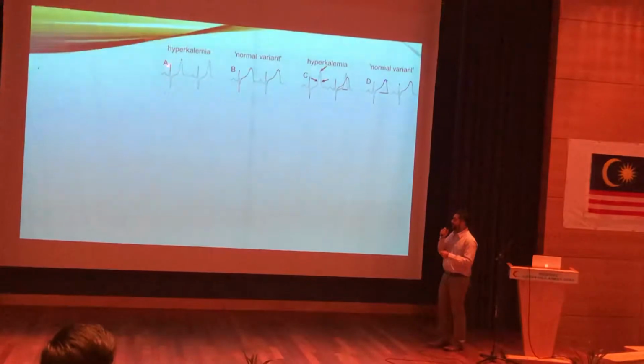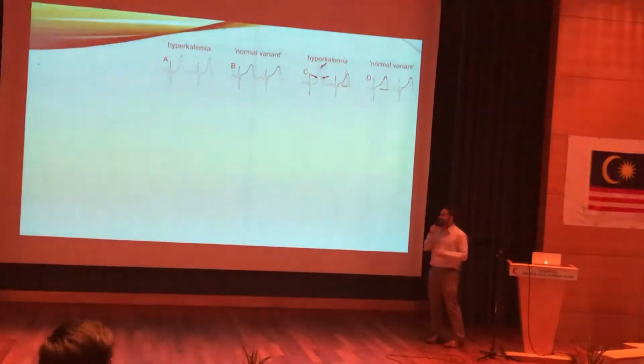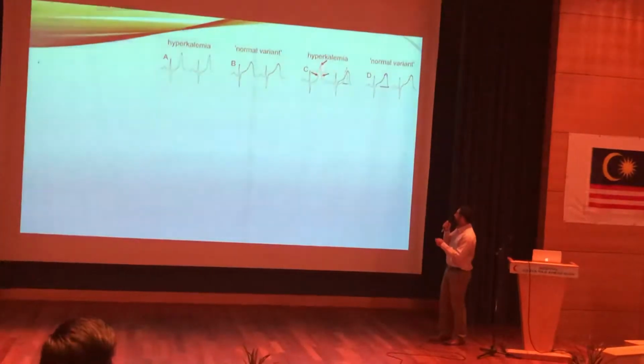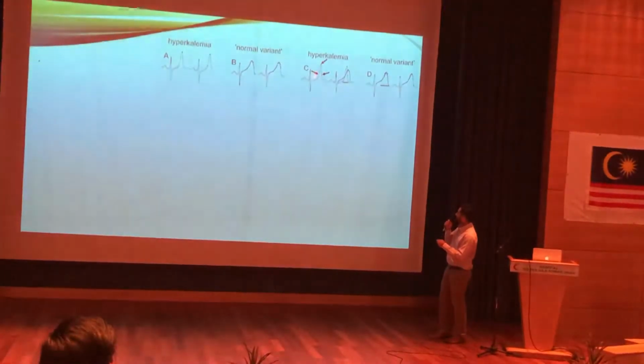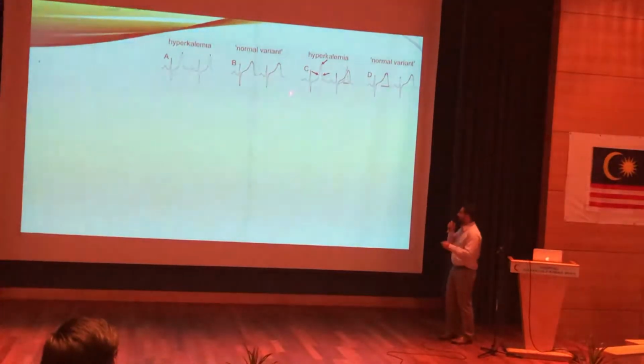This looks like a tent. This looks like a very weird tent. Correct. Look at this. It's as if this T wave is actually pinched from the sides. It looks like a proper tent. It looks like a tent that you want to live in, right? Not a tent that's like this.